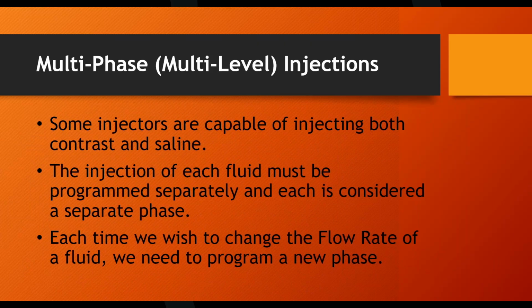All right. Any questions? Different injector models: some will do 4 phases, some will do 6 phases, some will do 8 phases. It's kind of depending on the machine and the model. But pretty much every injector is capable of a single or a multi-phase injection. Any questions on any of that so far?